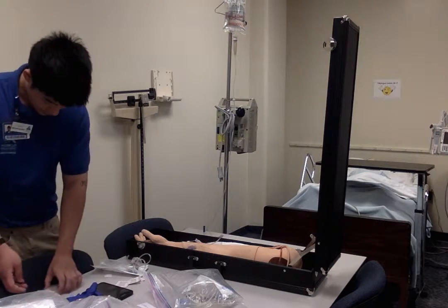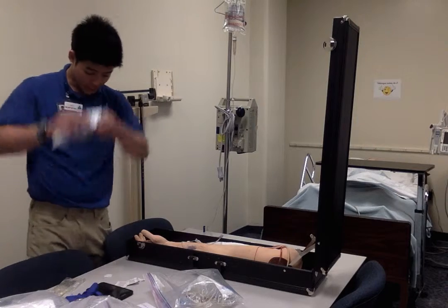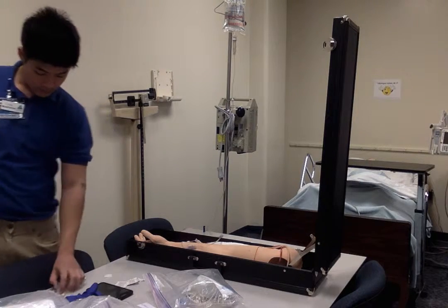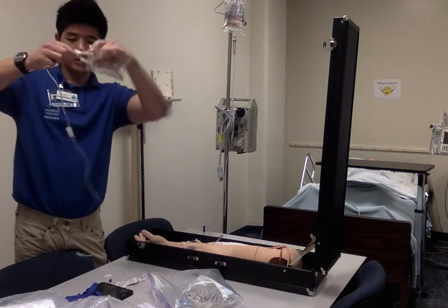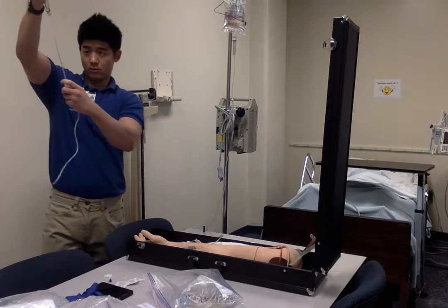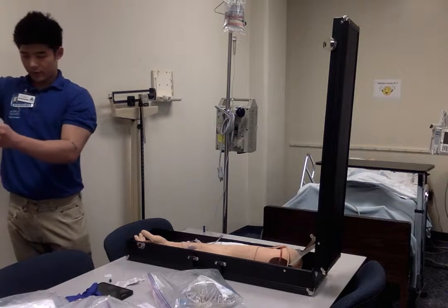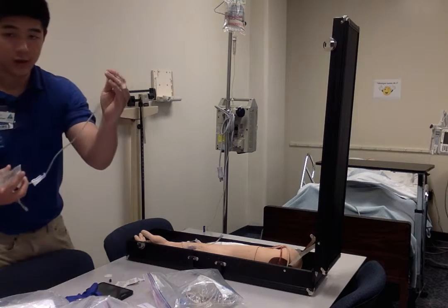All right. So, assume that this is flowing. What I'm going to now do is prime. Let me go ahead. Take this off. Make sure it is locked. Here we go. I'm going to go ahead and put this back. Attach it. Okay. Slowly, I will prime. Slowly. Okay, here we go. This is good. Now it's primed. And this is sterile on the bottom.